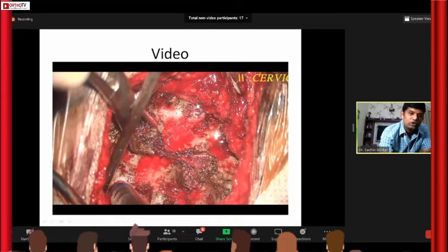So we have reached till the lateral aspect of the lateral mass on both sides, and now we divided it by a vertical line and a horizontal line into 4 parts, and below the center of the lateral mass, 1 millimeter below and medial, is this entry point. Am I clear? This is the cranial, caudal, midline, lateral. This is the lateral mass, quadrangular block of bone. This is the lower lateral mass, C4 lateral mass. This is on this side and this is on this side.